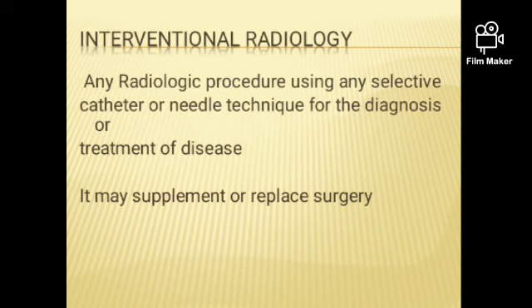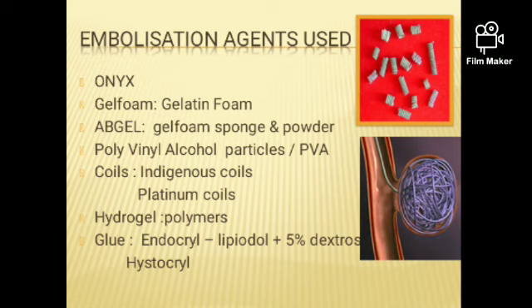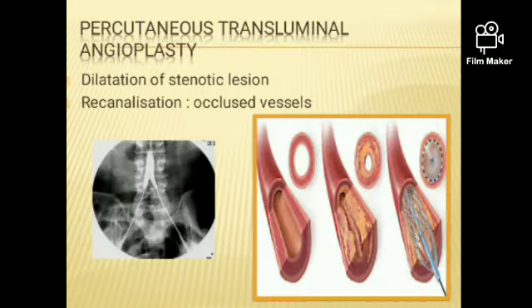And finally, we have interventional radiology, which we do for treatment purposes, and that is angioplasty. We have two types: balloon angioplasty, and embolization, where we use some embolic agents. These are the embolic agents. We use them for the repair of the arteries.